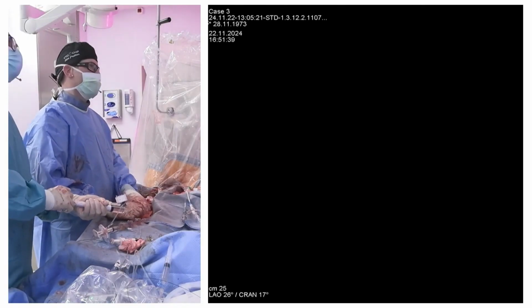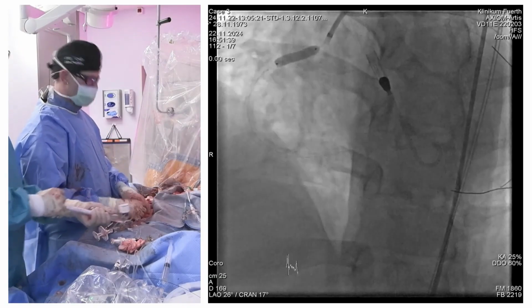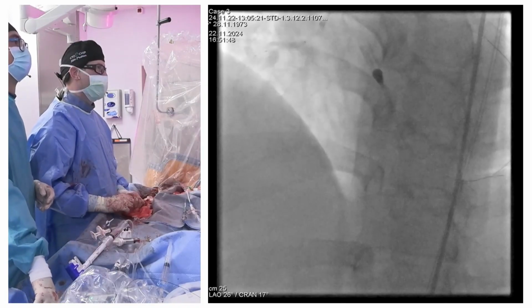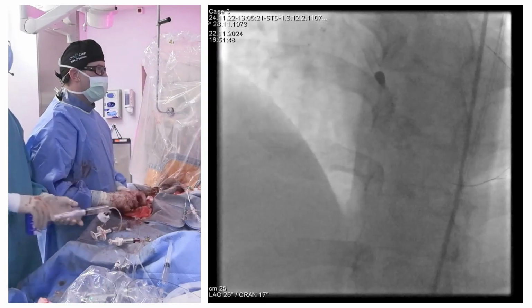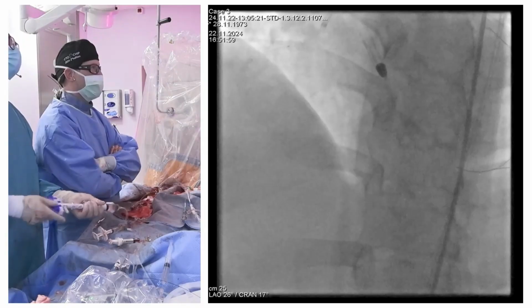That's what you say about the dilating balloons. The question is that we really need to see the real dimensions. For example, in this particular case, you know, there's a 4.5 vessel. We can't fix this with a 2.5 balloon. It's impossible. Completely right. And so I think we will learn again to skip the stent in some instances, yeah.